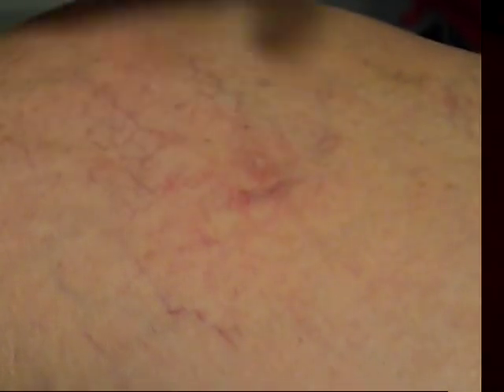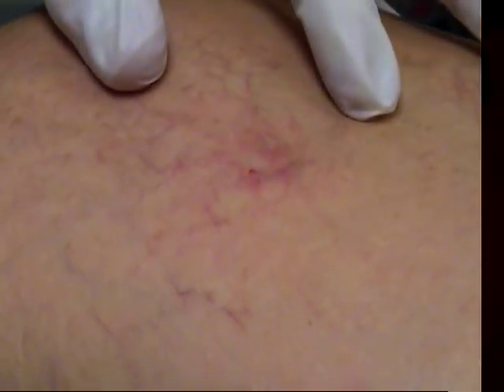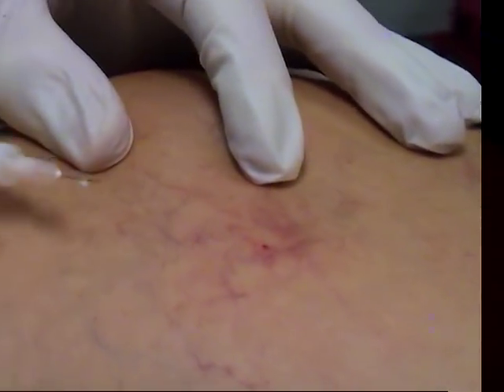You can just see it refilling now centrally, but still a lot of this has not refilled. Very often — actually I squeezed it, you notice I squeezed it right there, and it came back more quickly. I'll show you that in just a minute.